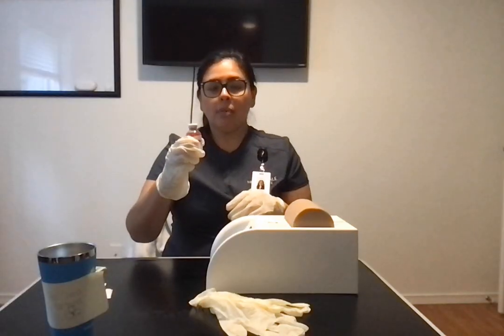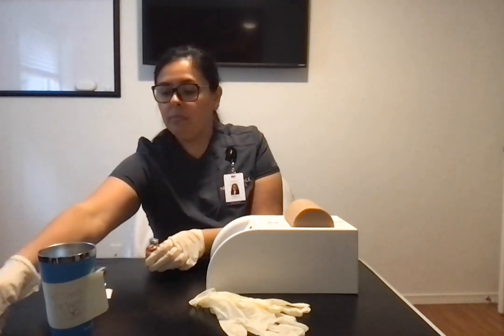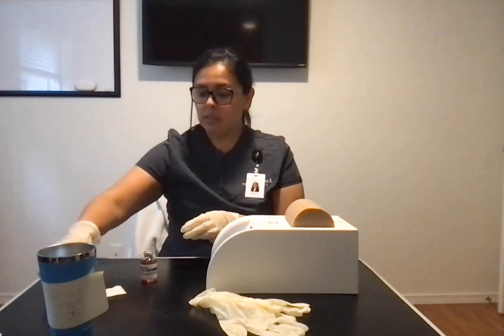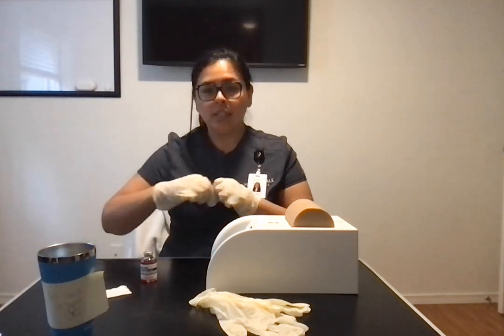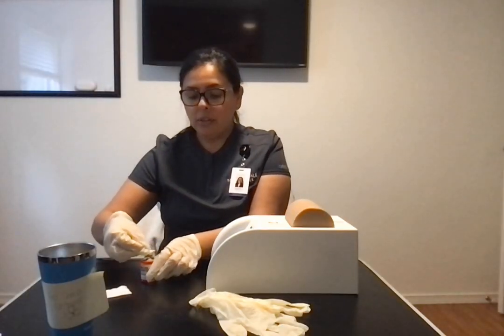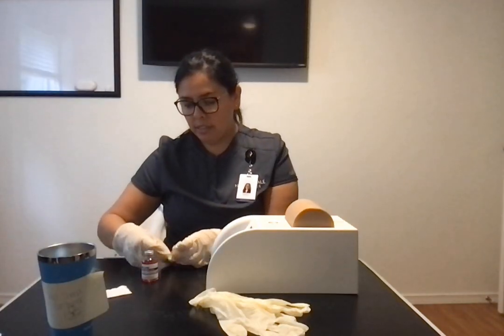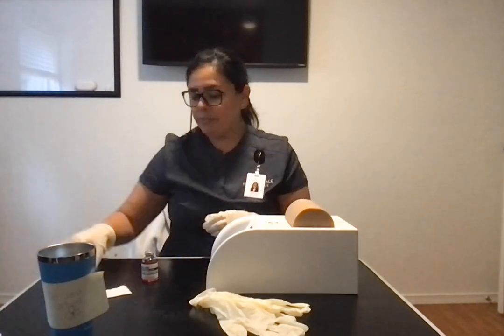This medication has not been opened yet, so I will go ahead and remove the cap. Put that in the trash. Next, I'm going to clean the top with an alcohol wipe. Even though it's a new bottle, we still want to make sure that it's clean for the patient. Put that in the trash as well.